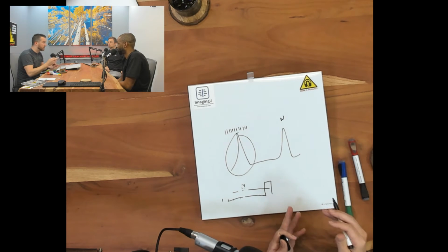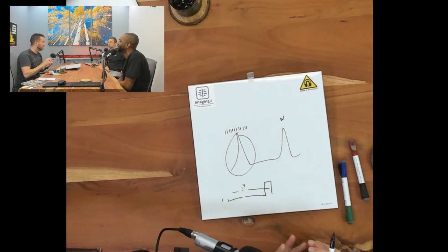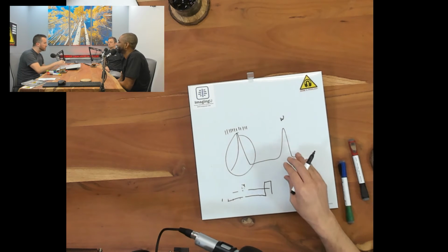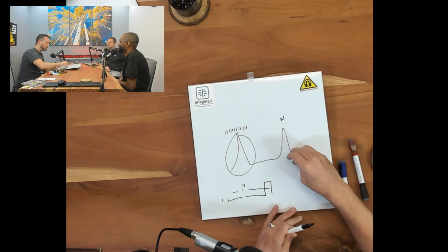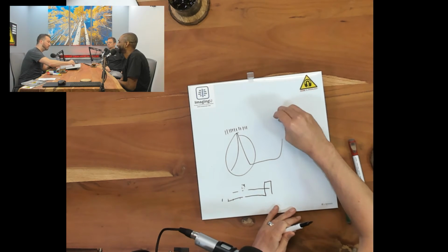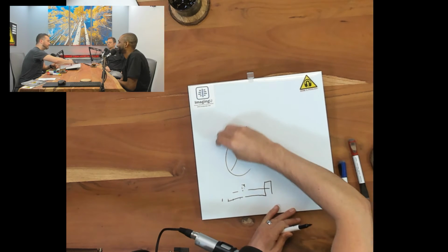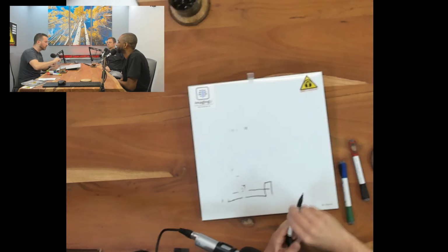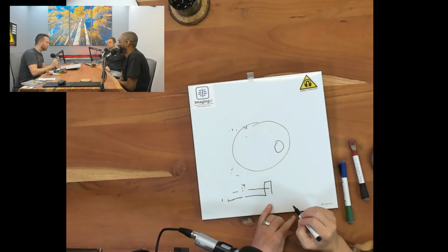And then it doesn't get to play the game. Then we follow up directly after that with just a regular pulse, and everything with water gets to play the game. But think about it. If you have a sweet little grandma and she can't put her arm Superman style or something like that, you've got her in the bore, and her elbow is over here.